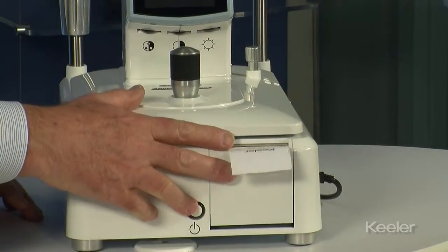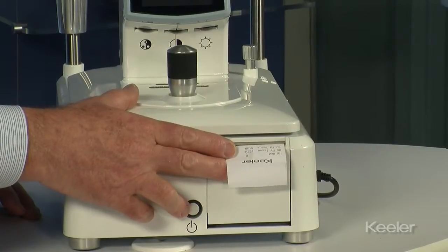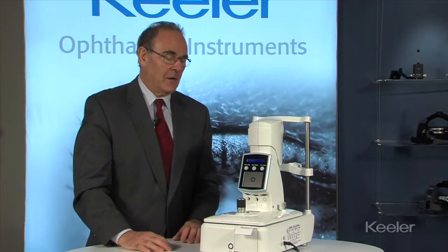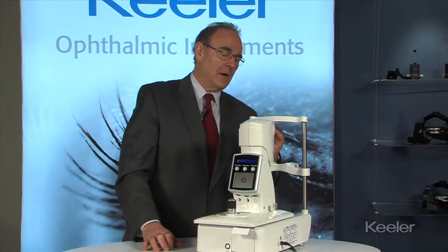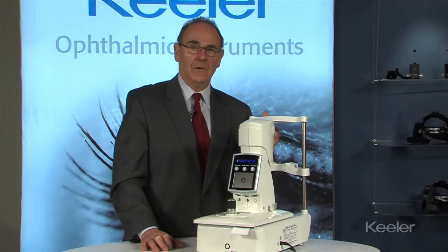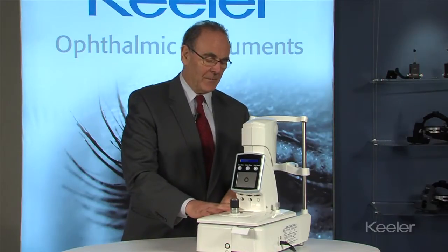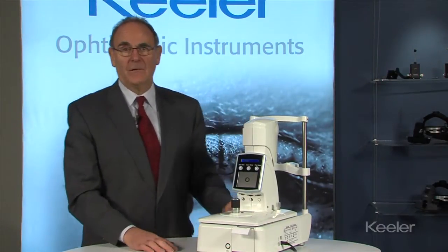On the front we have the printer paper and the printout will give all readings taken for left and right eye. On the maintenance side, basically the only check that has to be made is of the lens around the puff tube on the front, and you can use a Q-tip with alcohol to make sure that it is clean. That information is contained in the operator's manual of the desktop Pulsair.